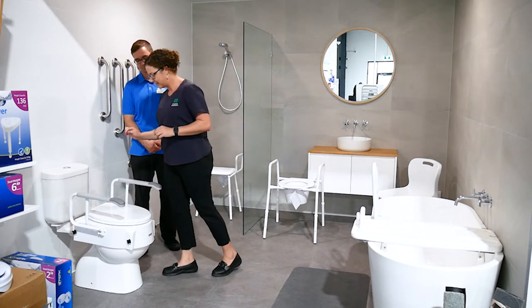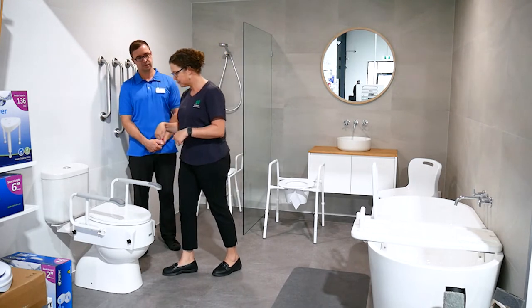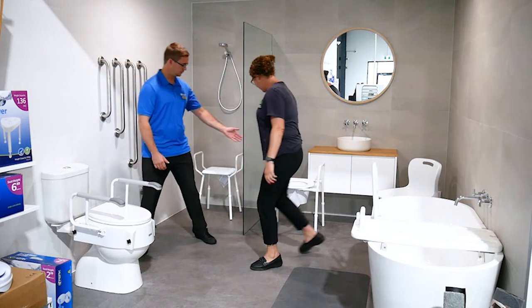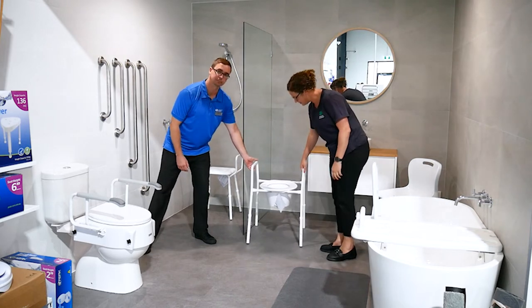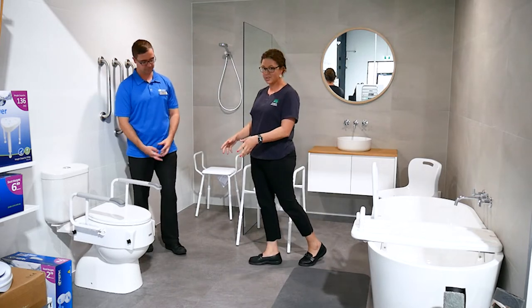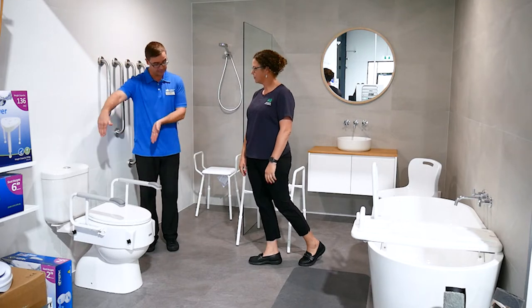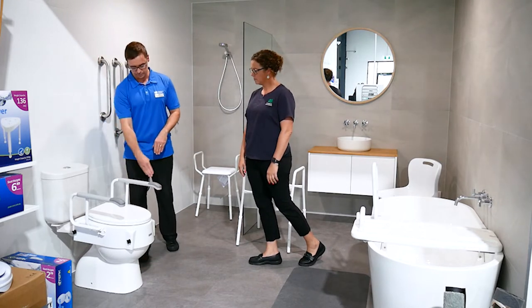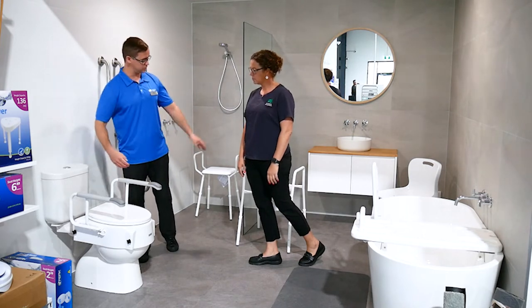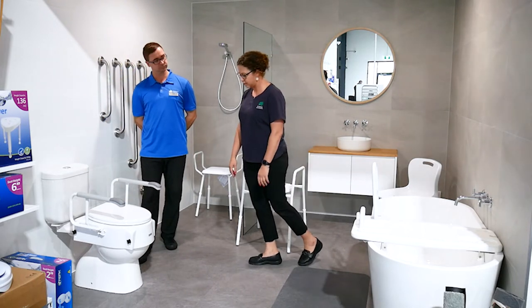The side thing is that it will only actually fit the toilets that have the drop-down pins at the back of the system. But for people, instead of using our standard toilet aid, which can create a bit of a hazard around the toilet and it's not as easy — it can be a trip hazard — and in a lot of bathrooms it can actually not fit sometimes. I'm picturing a bathroom that maybe has the footprint of a bath right next to the toilet and the wall. Sometimes these can be really hard to fit there, as well as cleaning around them.